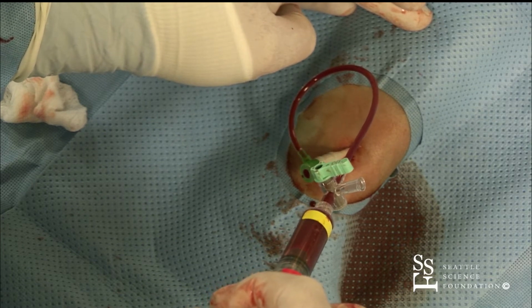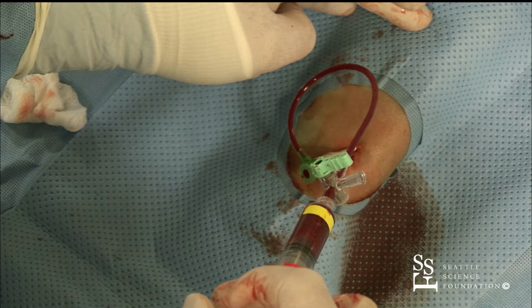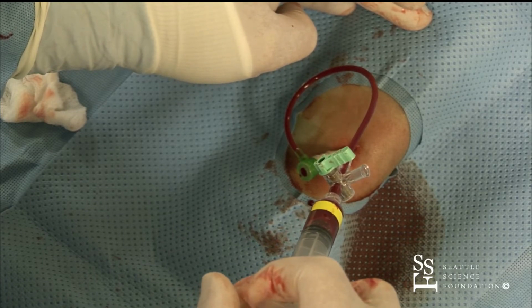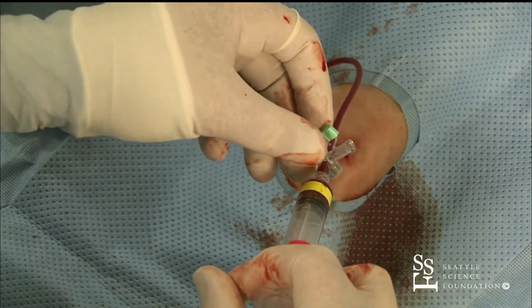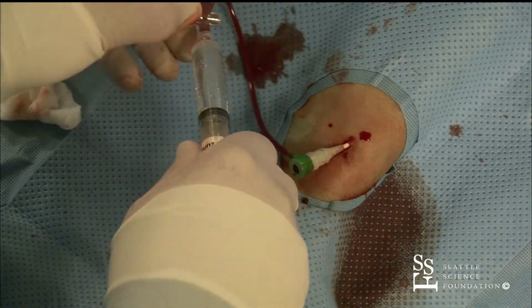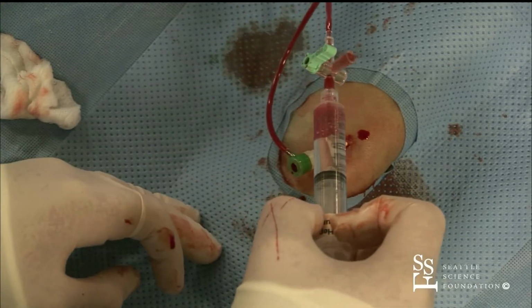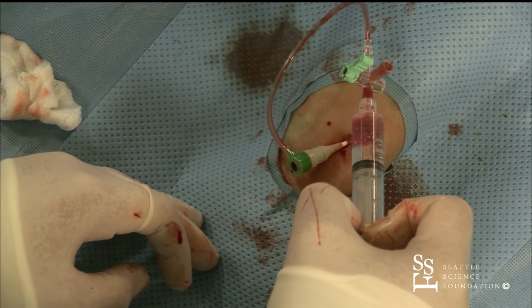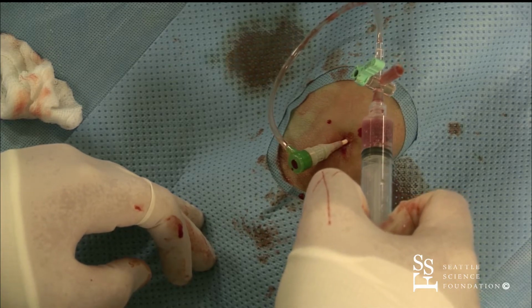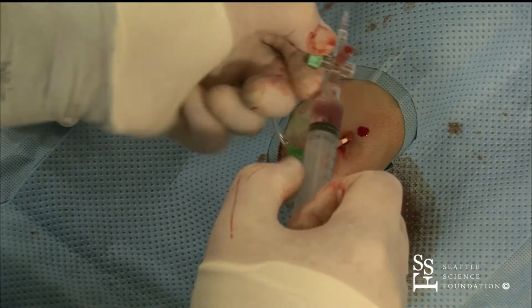The hub is gray, and the 6 French sheath, the hub is green. Here I have a combination, so it means that the outer diameter is of a 5 French, but the inner diameter allows the passage of a 6 French diameter. So that's a color coding. You see that the little hub is green, and then the next part down is gray. So that would be a 5/6 slender.